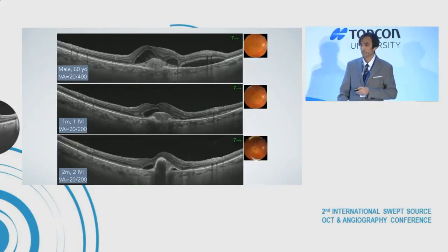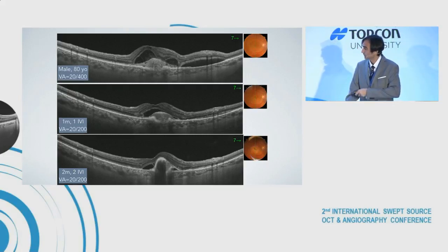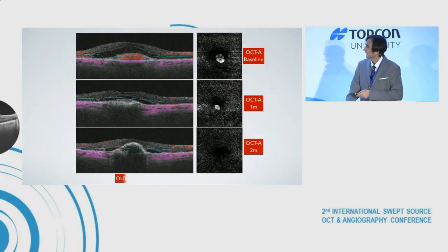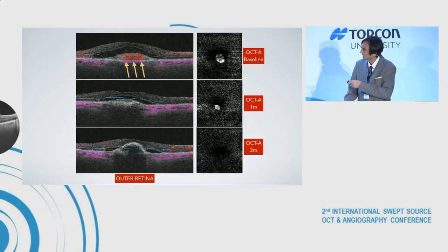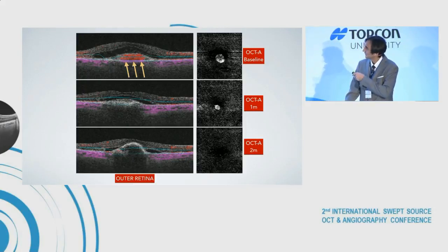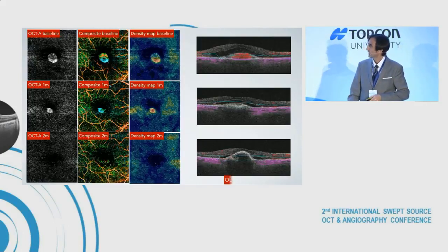Another case: this patient presented at baseline a type 2 CNV. This patient developed a rip of the RPE after several treatments. We can see very clearly that the important blood flow signal present at baseline disappeared after treatment with a clear regression of the neovascular complex, despite developing this rip of the RPE, and the reconstruction of all this case is shown.